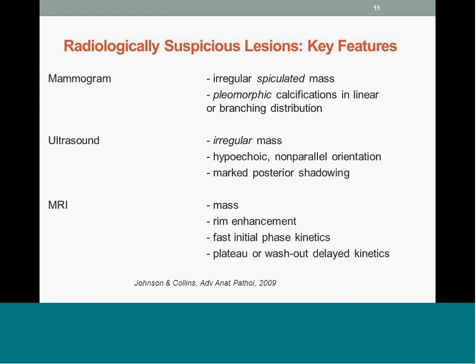Similarly, if they say that there are pleomorphic calcifications present, then I'm looking for DCIS by and large. And if I don't see it, then I may do deeper levels or special studies, or issue a report that indicates that there's discordance. On ultrasound, usually you get told that there's either a circumscribed mass or an irregular mass, and an irregular mass, of course, is more suspicious.